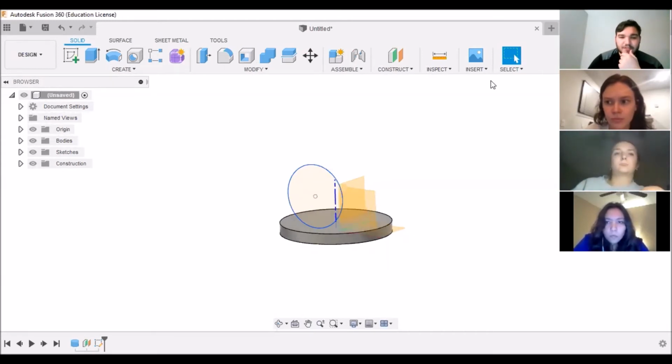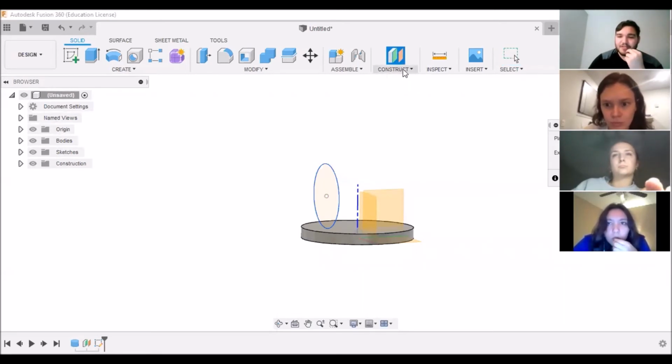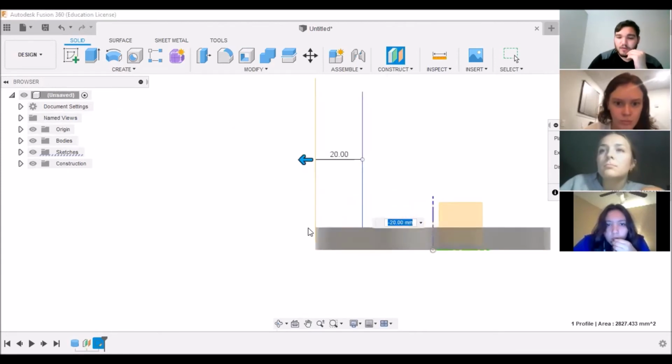Now we're going to get super fancy and create another offset plane from that one. So the offset plane is just the most basic of the construct. So if you just want to click the construct plane instead of having to do the drag down, you can do that as well. And now essentially the sketch that we made becomes a plane. And so you can create a sketch off of that and then bring that right to the edge of the base that we created earlier.